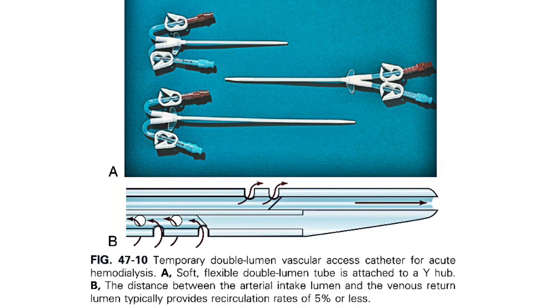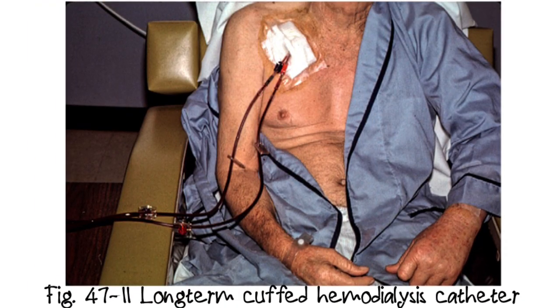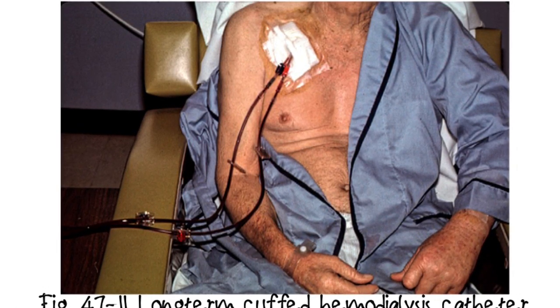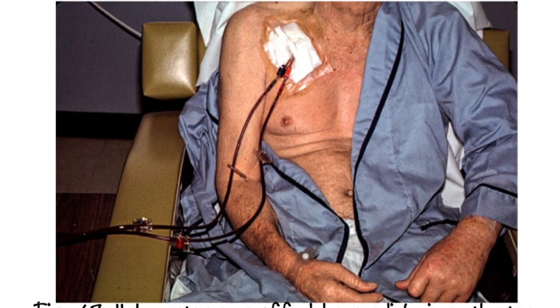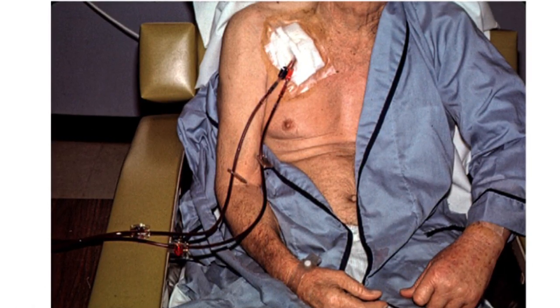The catheter usually consists of a double lumen with an internal septum separating the two internal segments. One lumen is used for blood removal while the other is used for blood return. Recommendations are that clients remain hospitalized while temporary catheters are in place due to the high rates of infection, dislodgement, and malfunction of these devices. Temporary access can also be achieved through the use of long-term cuffed hemodialysis catheters. These catheters provide temporary vascular access while the client awaits fistula placement, or can also be used for long-term access when other types of access have failed.